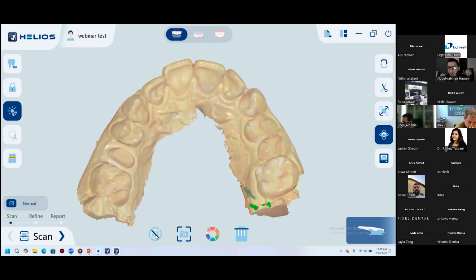The main function of the AI is soft tissue filtration. So whenever I'm scanning soft tissue and the AI is working, it's actually filtering out and removing the excess soft tissue. And in such a scan, I do want to scan the soft tissue. So whenever you have a completely edentulous case, close the AI and try scanning. And please supply me with a video of the AI?